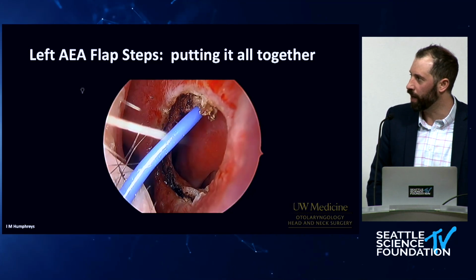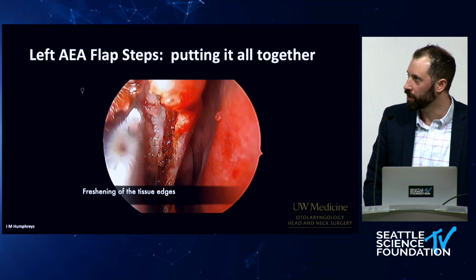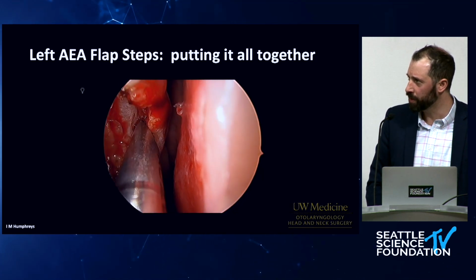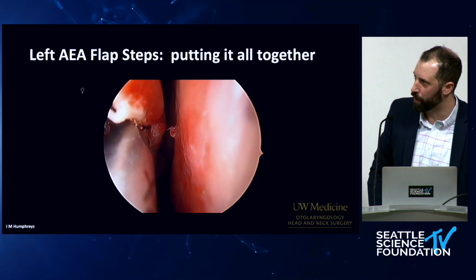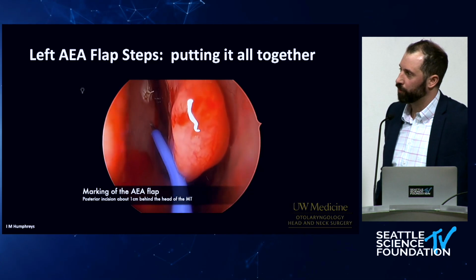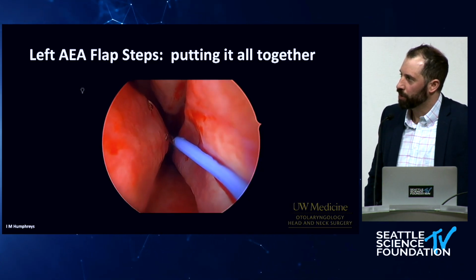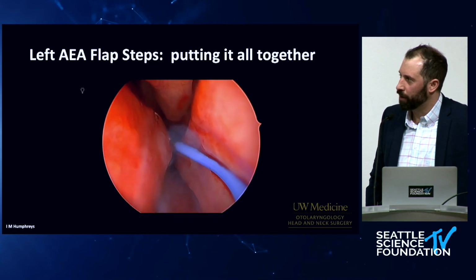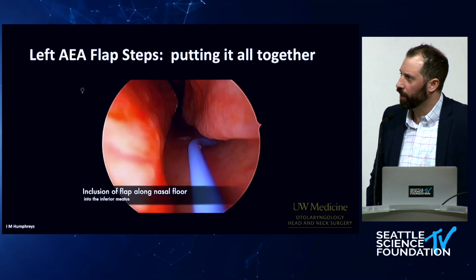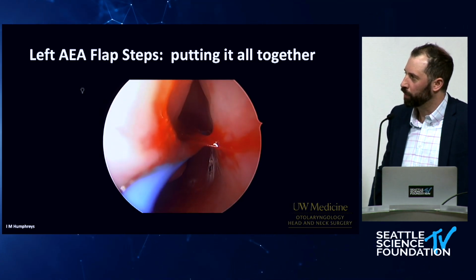This is division of the flaps, as I mentioned earlier. This is the pain point, that anterior one, using whatever tool you like to further separate it. Identify the cartilage. In this case, this was a traumatic septal perforation from nasal cautery, repeated silver nitrate cautery. That's that vertical incision, so starting off posterior to the anterior edge of the middle turbinate, coming down the nasal septum. I'm just marking this out. I work in a teaching environment, so it's helpful to have these discussions and really try to formulate our plan together.